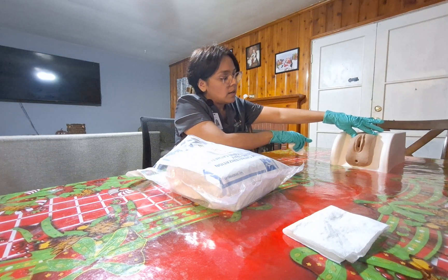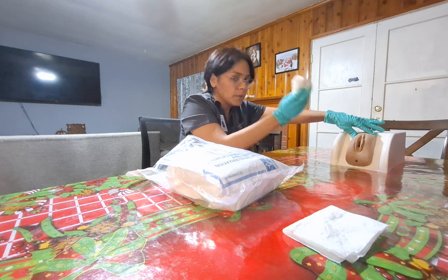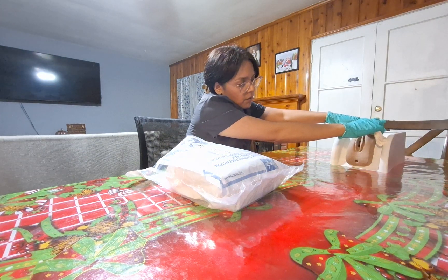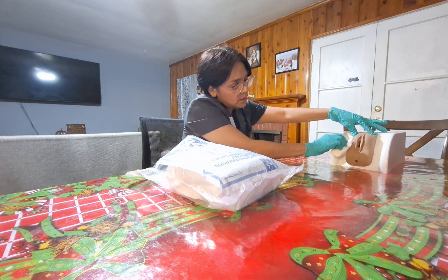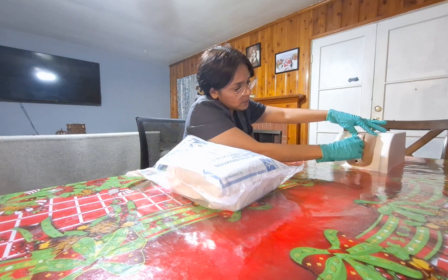I just want to note that I'm on the patient's right-hand side and my dominant hand is my right hand. I'm going to go ahead and toss this away. I'll take a dry cloth and dry the area again, following the same steps — top to bottom on the far side, top to bottom on the near side.